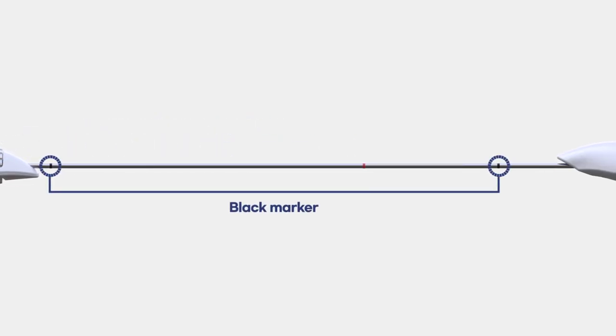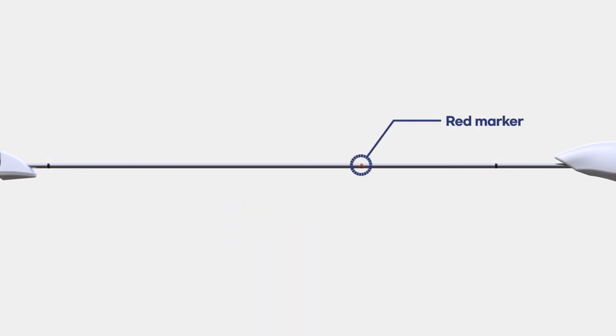Proximal black marker indicates the full deployment of the stent. Red marker indicates the recapturing limit or point of no return.